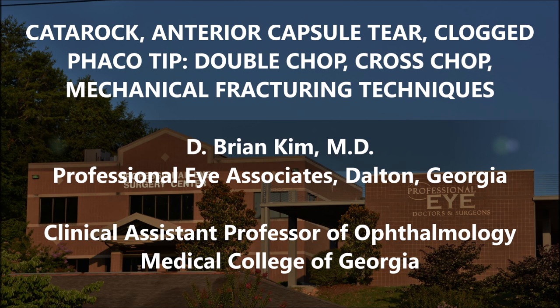This lens is so dense that when I did chop it, it actually clogged the phaco tip. This has happened to me on multiple occasions when I was on mission trips doing cataract surgery on really dense cataracts. You can see that the tip does get clogged — I have to stop and flush it out. You're also going to see a sub-incisional anterior capsule tear, and how it happened and how to avoid it in the future.